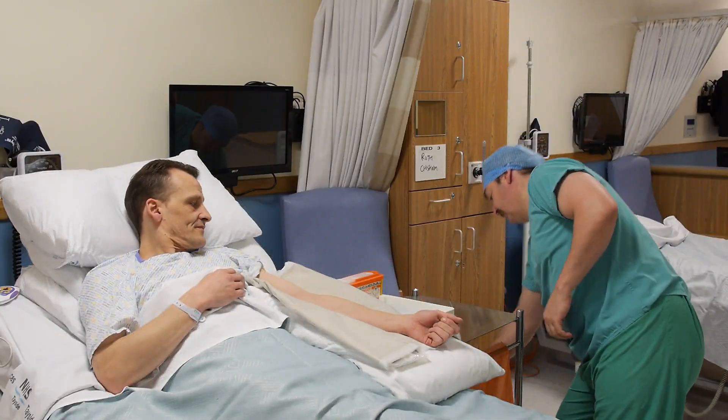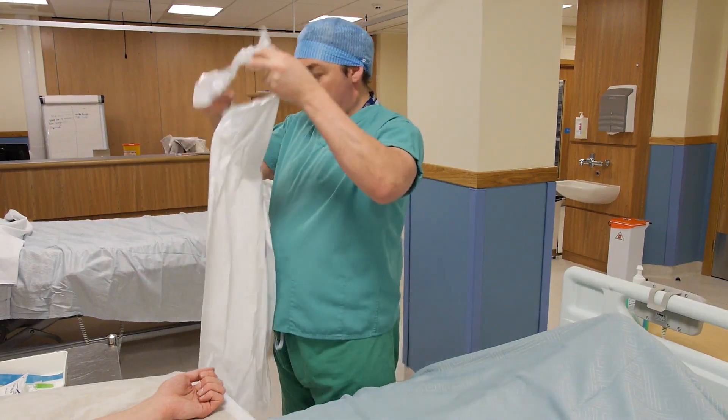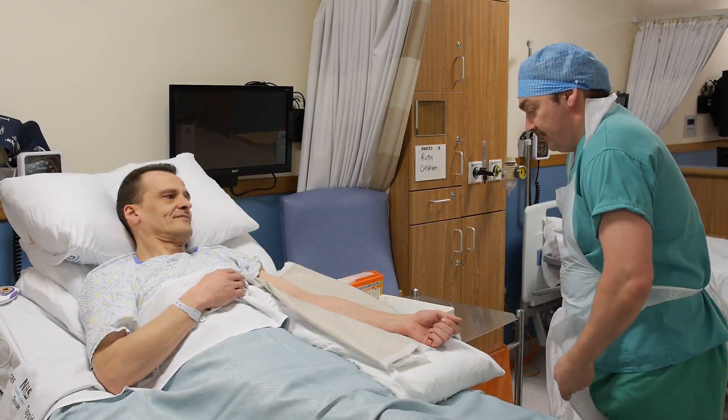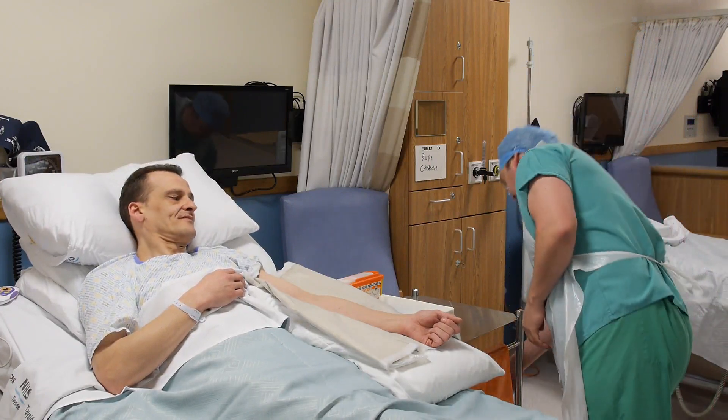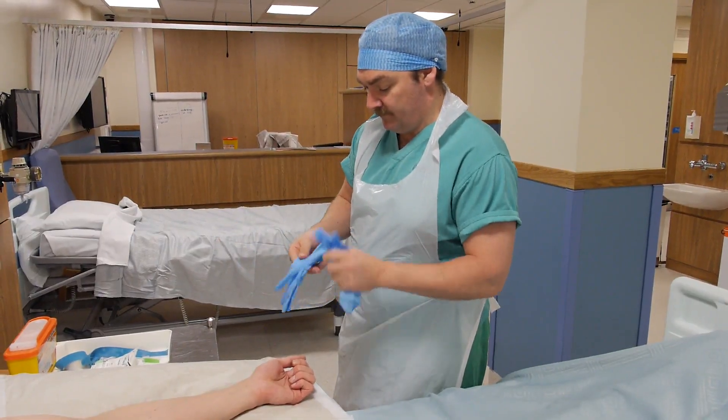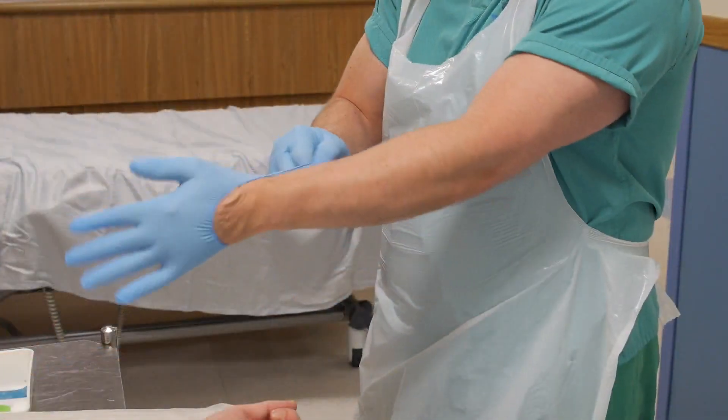Basic personal protective equipment provides a barrier to body fluids and microorganisms and should be readily available in the clinical area. Don a disposable apron and remember to put on a pair of well-fitting nitrile gloves for this procedure.